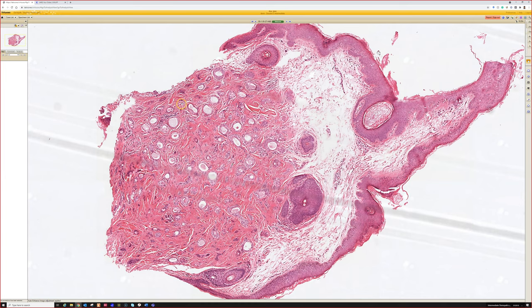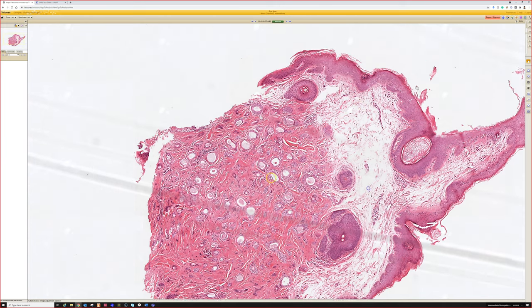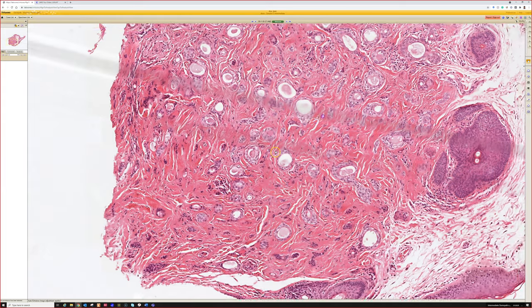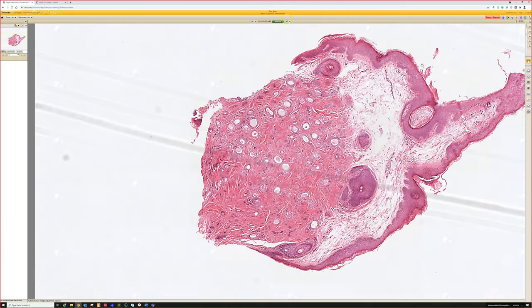Look, it's another syringoma, right? And it's got that perfect, dense, sclerotic collagen stroma that's all its own and totally separate from the edematous eyelid dermis over here. And then the little round circles. This one has clear cell change also, and it's got the dried sweat secretion inside of it. And sometimes you'll see the little tadpole shape like here, but other times it'll just be little tiny circles. Syringoma.